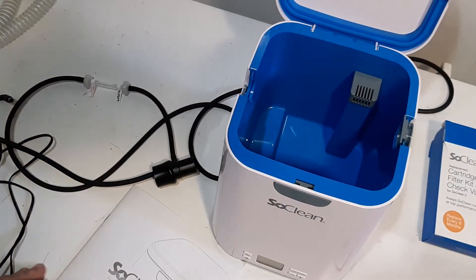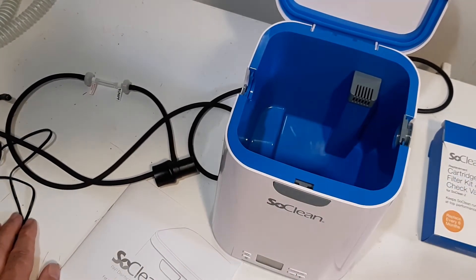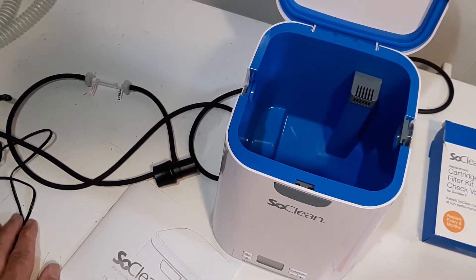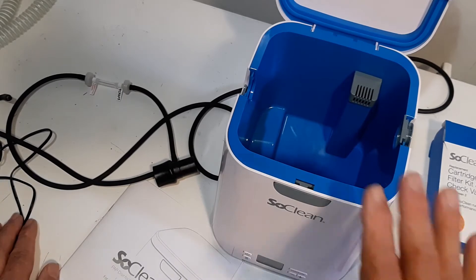One thing I'll say about the SoClean — depending on your mask, a lot of people have just a nose mask. I have a fairly big full face mask, and it has just enough room in there. It's a little bit tight — a little negative thing about this, a little bit small.